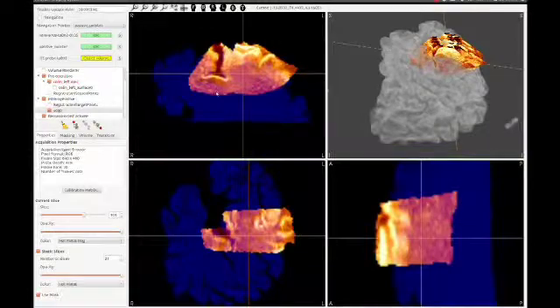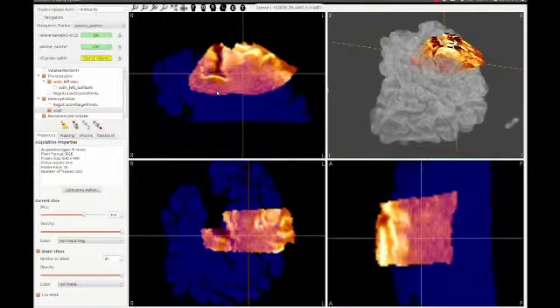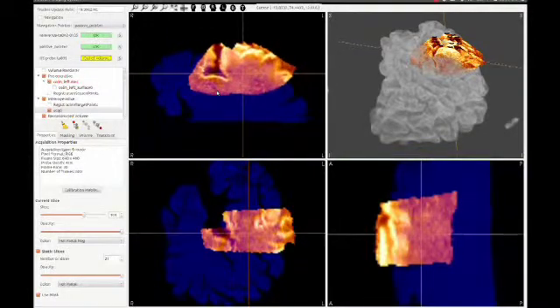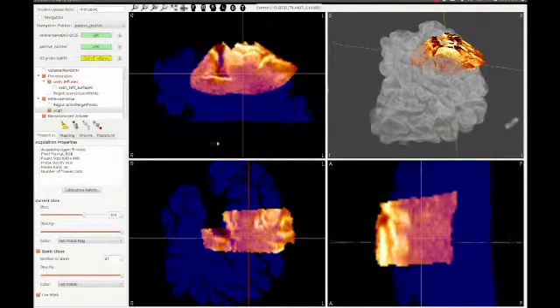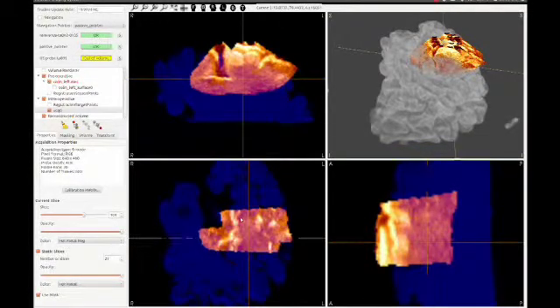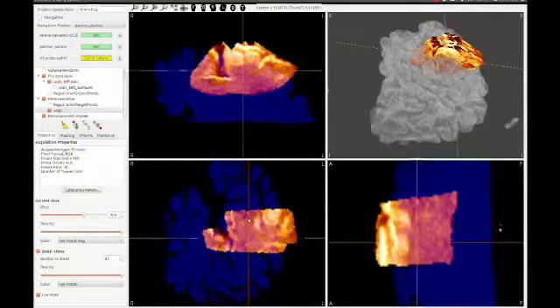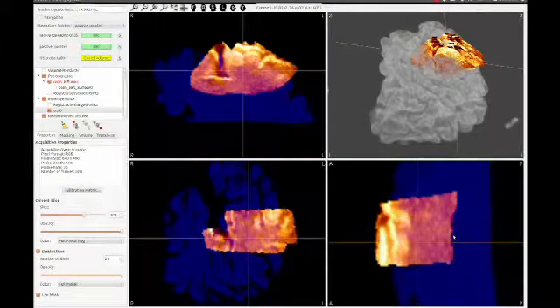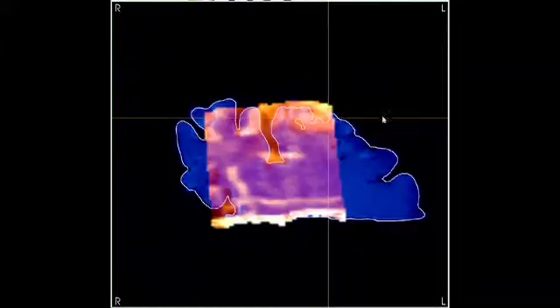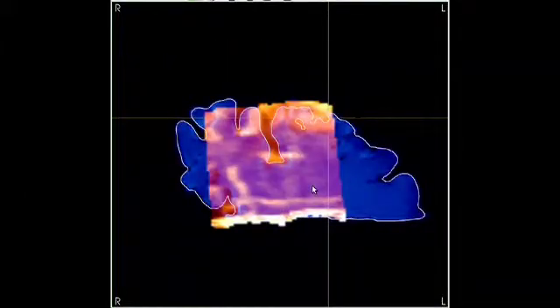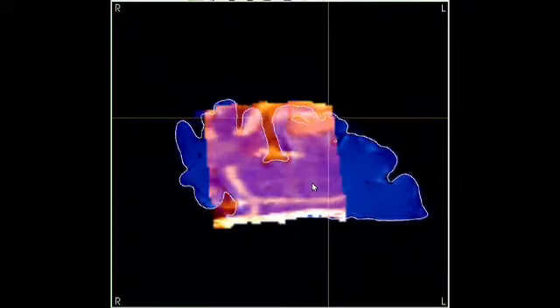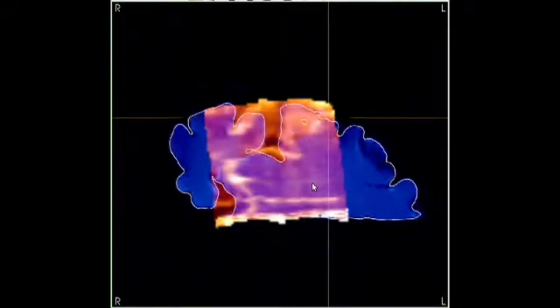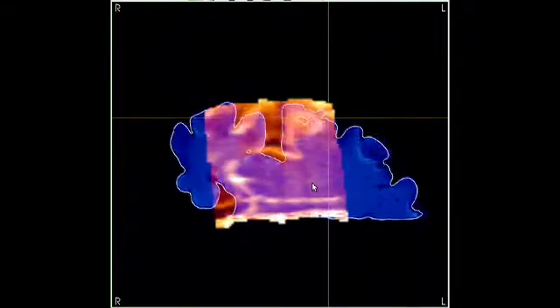The acquired ultrasound images can be reconstructed into a 3D volume and re-sliced into the axial, coronal, and sagittal planes. For this demonstration, we can focus our attention to the axial plane.